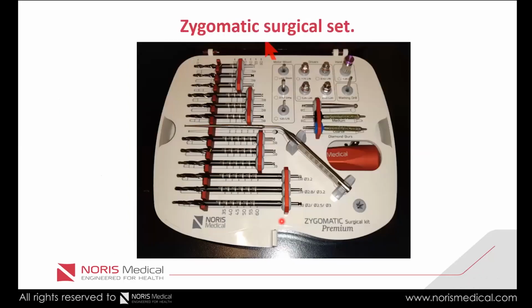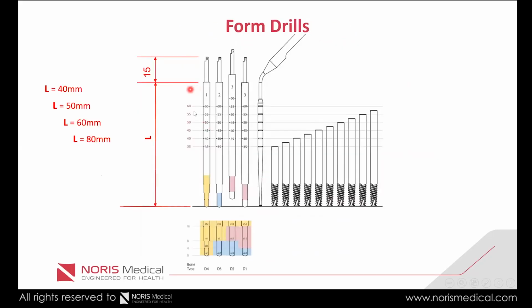The surgical set includes drills with lengths from 80 millimeters long down to 40 millimeters long to enable working in the very crowded space of the mouth. The implants themselves, as I said, these are the lengths, 40, 50, 60, and 80.